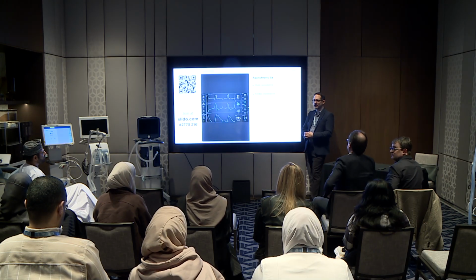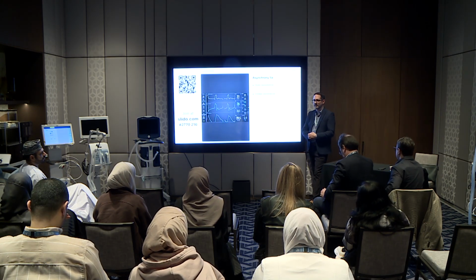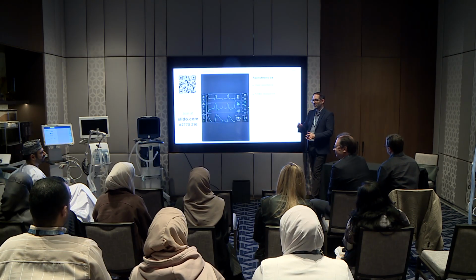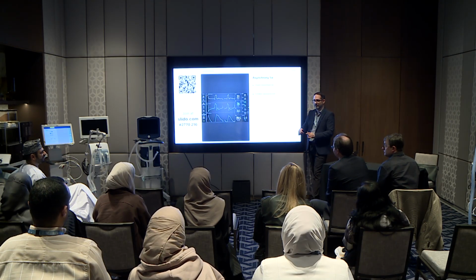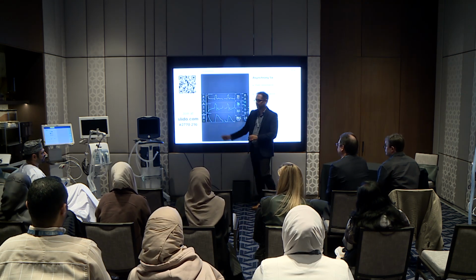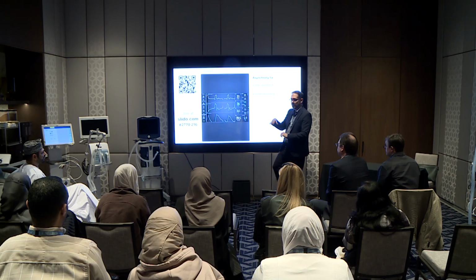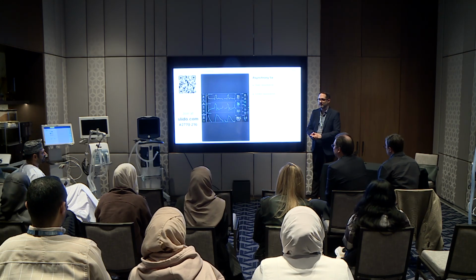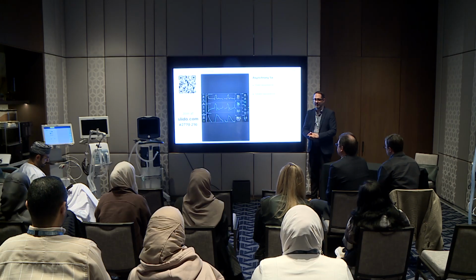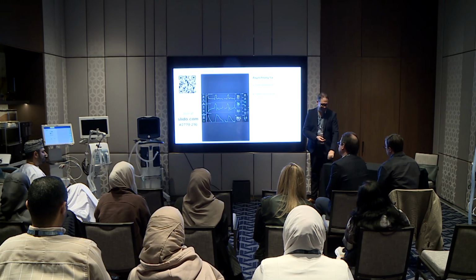It's out of Spain, actually. In Canada, Draeger distributes it. It has nothing to do with the ventilator, it's actually a computer for it. But it will connect to the back of any ventilator. So BetterCare worked with every manufacturer, and they can interpret the data being sent out the back, and it will interpret all of the types of asynchronies. As much as I'd love all of us to know how to recognize this, I acknowledge that if you had a computer doing it, it takes a lot of work out of it.